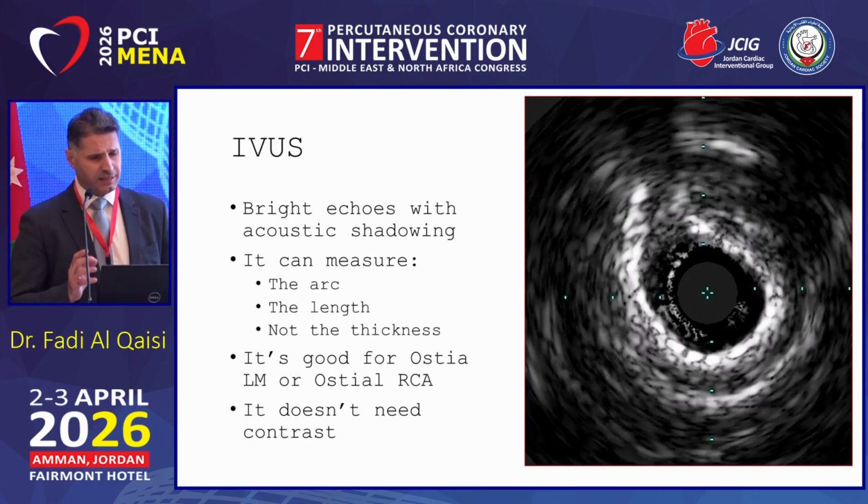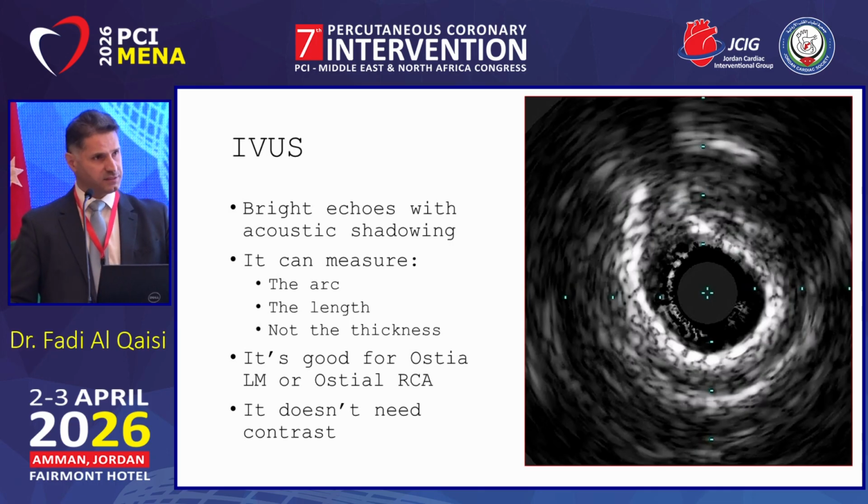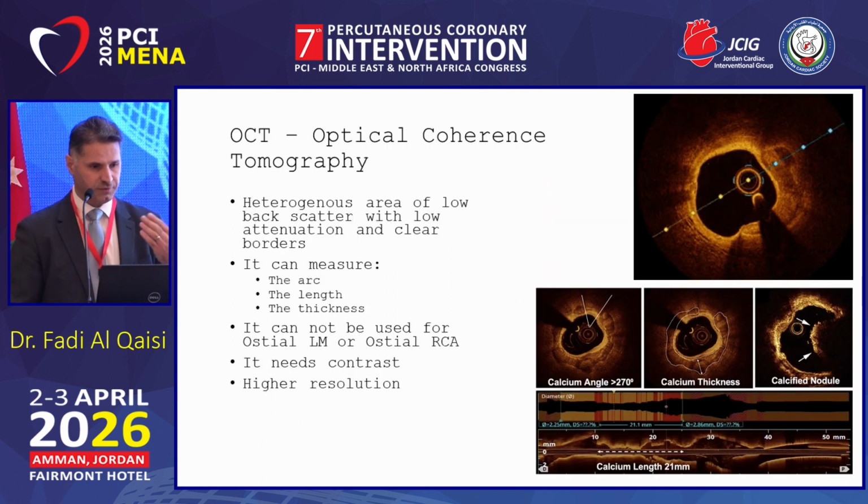الIVUS بيبين الكالسيوم bright echo shadowing. You cannot see beyond the calcium. بيقدر يفرجينا الارك, length, but not the thickness. The calcium, the ultrasound cannot penetrate calcium. It's good for ostial left main, ostial RCA, and it does not need contrast. So this is very good. You can do as many IVUS as you want during the case.